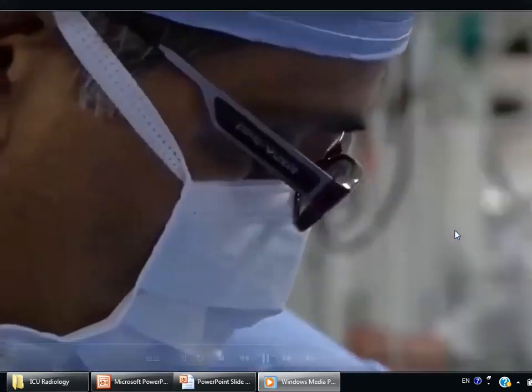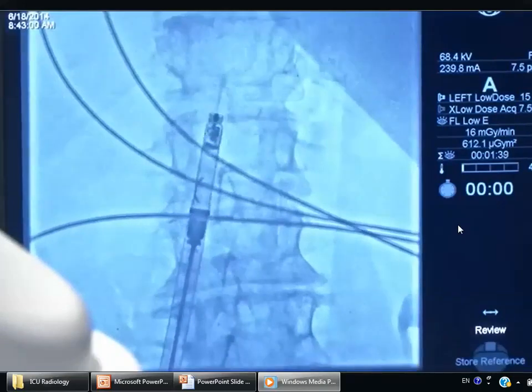Dr. D.J. Laccaretti is the electrophysiologist who implanted this first device, part of a clinical trial, and he says the advantages for patients are tremendous.